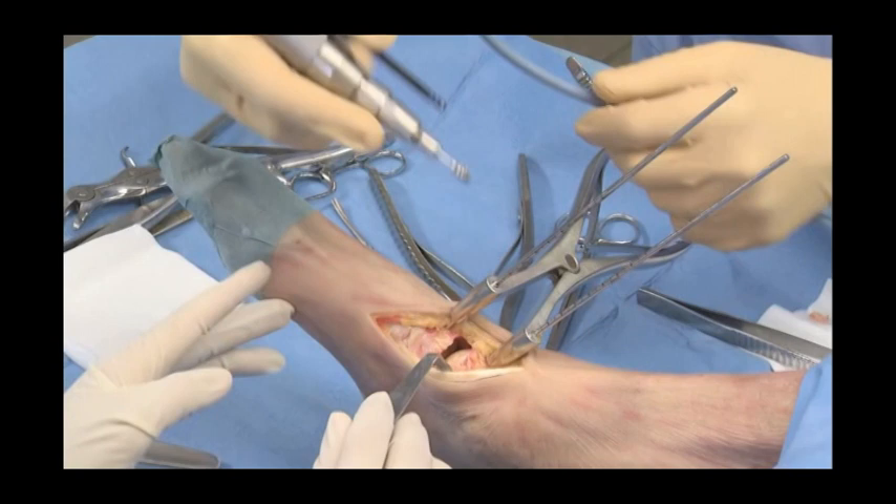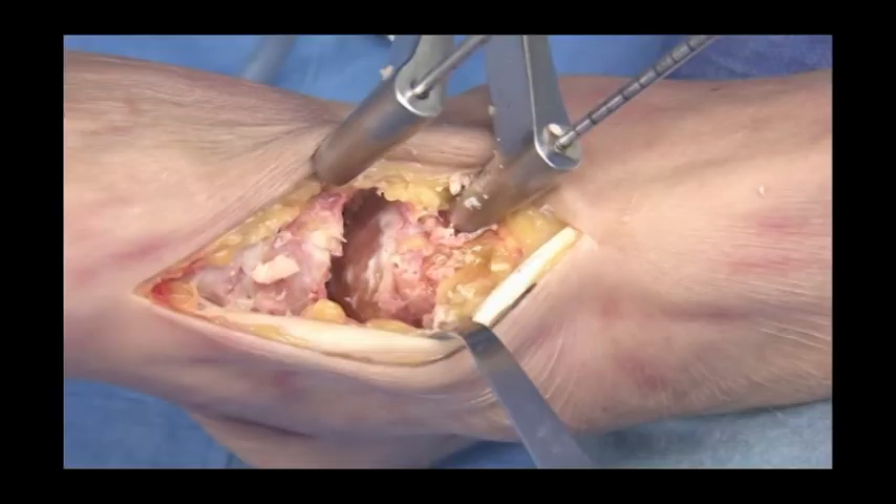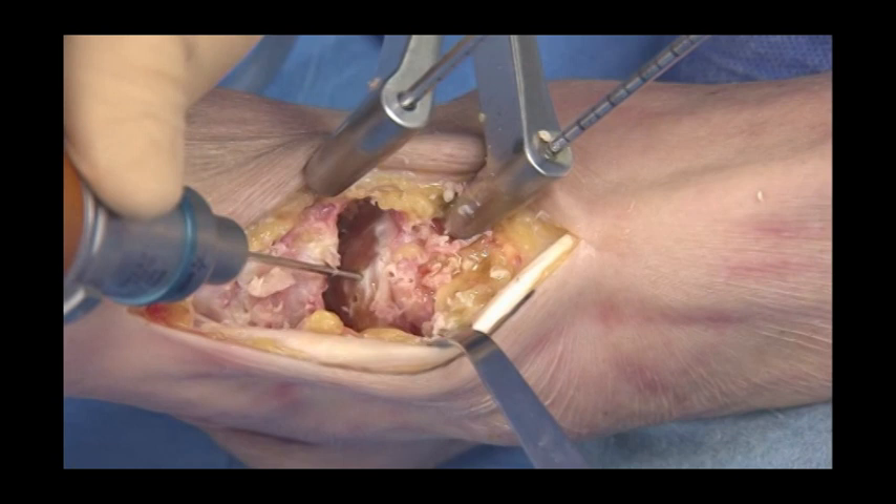Joint preparation is completed with a high-speed burr in order to preserve as much bone as possible. Once the cartilage is removed, the subchondral plate is drilled or scaled to achieve bleeding surfaces.